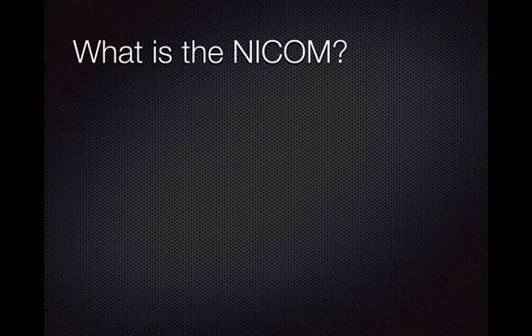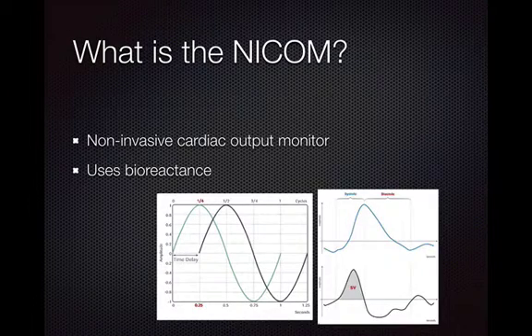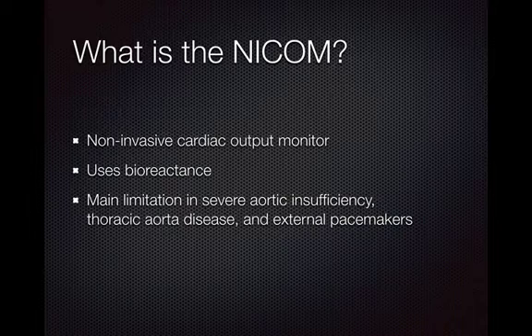So what is NICOM? It's a non-invasive cardiac output monitor, and it uses something called bioreactance. We really don't need to know it. Basically, it's voodoo medicine for all we care, voodoo science. You just know that it has to do with a voltage being shot through the chest wall into the fluid content, specifically your blood cells, and then there's a phase shift depending on the volume status, and that tells the machine the stroke volume beat to beat.